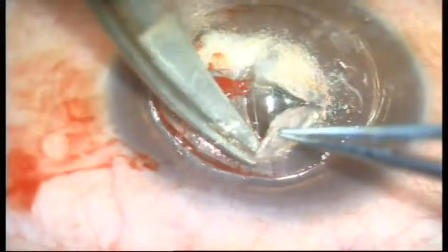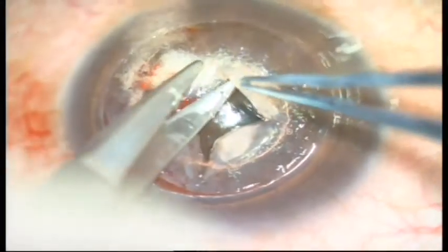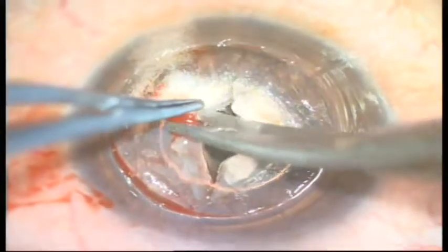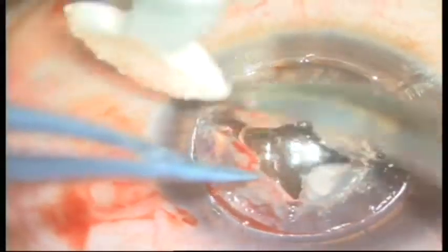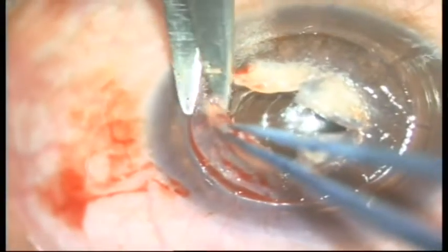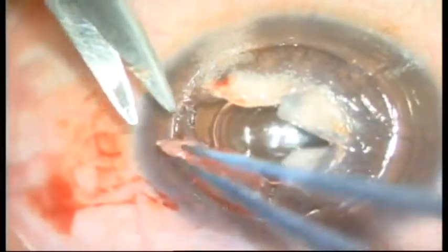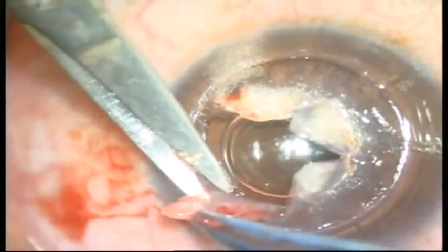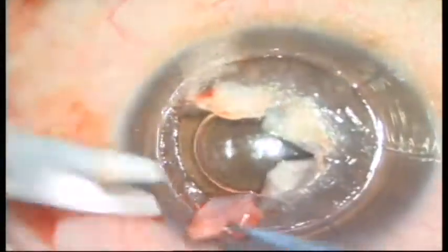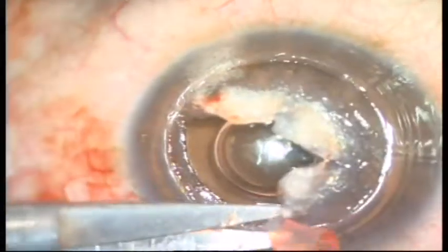As you see, the bubble was large, 8.5 millimeter with high pressure, and it extends to the limbus with a white edge at the periphery. Then dividing the 4 quadrants and exposing the Descemet and the endothelium with the rough surface because it is type 1. Removal of every quadrant, and here, because the bubble was not so complete, you'll find some of the edges of the deep cornea are still present, which we call the ledge of the cornea, that may sometimes hinder the healing of the donor and the recipient.